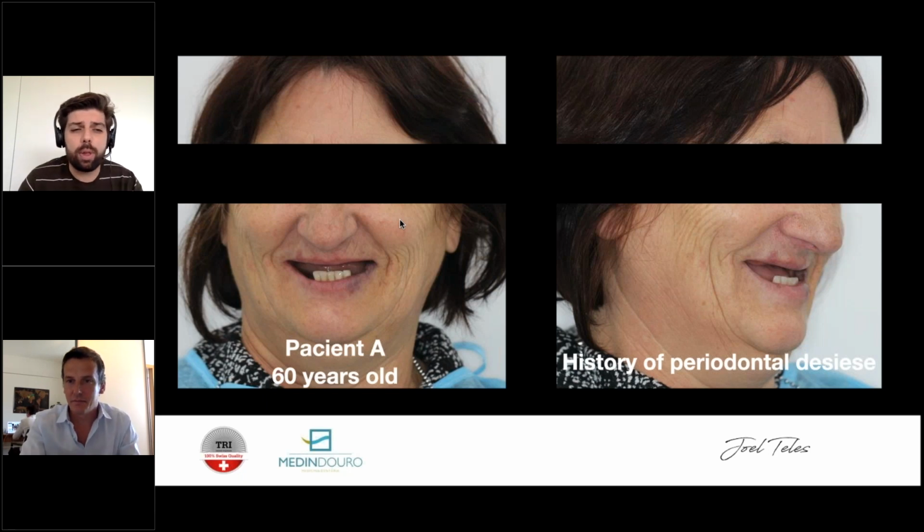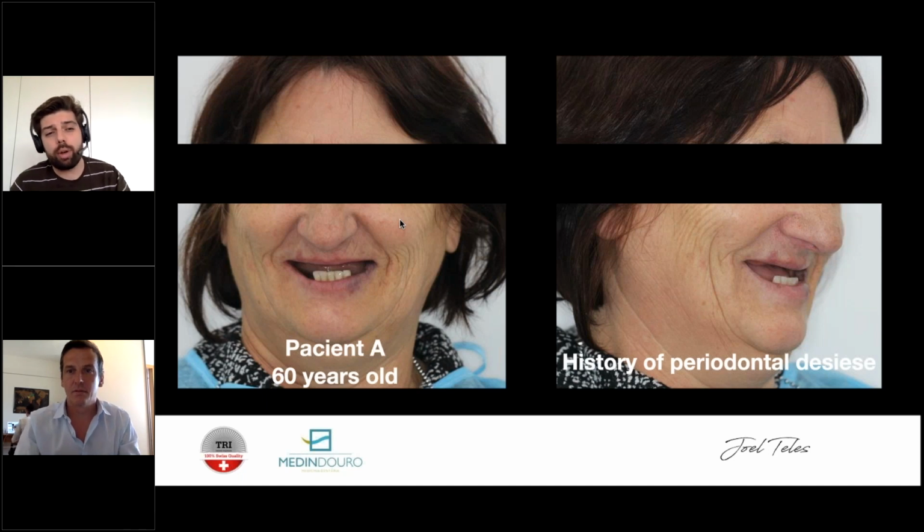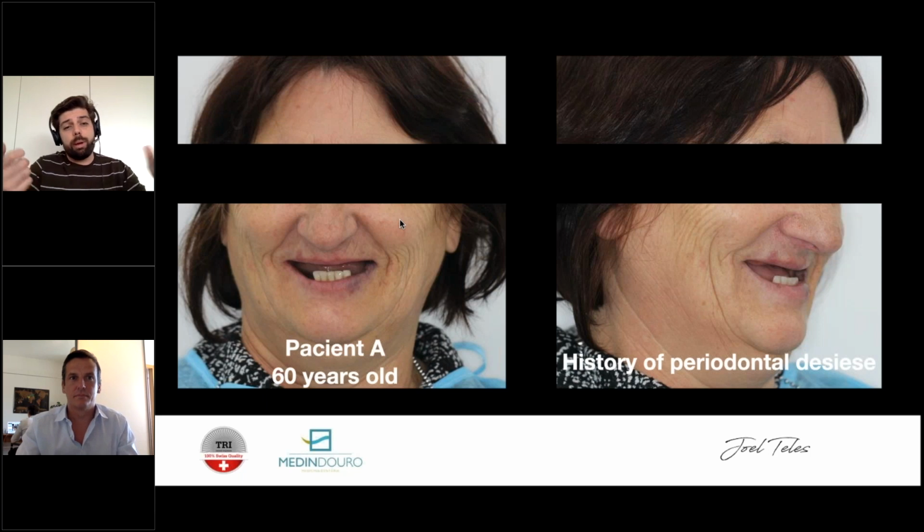If they're not osseointegrated, then at this moment being in load, because this is actually one of the few cases that were loaded since day 0. Once you're dealing with single crowns, you take it out of occlusion, but in this moment not. They are biting on this since day 0, so you will know if the implant is not osseointegrated in the end. Remember, you will detach all of these and go for final restoration, so there's a bunch of proof: you'll be screwing and unscrewing, so there's no doubt about this.